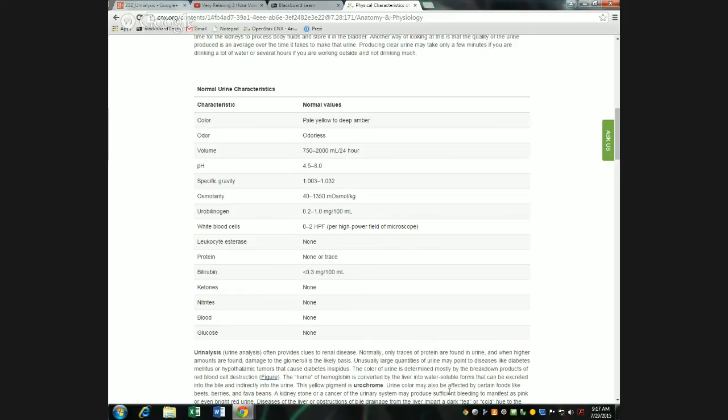We have one bottle that has some sticks in it, and then we have 3 more bottles that don't. These are empty. We have these, however, so that you can compare your stick to those as well as this one here. We have 4 bottles for all of you to work with, so there will have to be some sharing, but at least with 4 bottles instead of 1, you can make the rounds a little better. When you're coming up to get the stuff, get your dipstick and get a bottle if it's available, or be around somebody that has a bottle so that you can look at it.